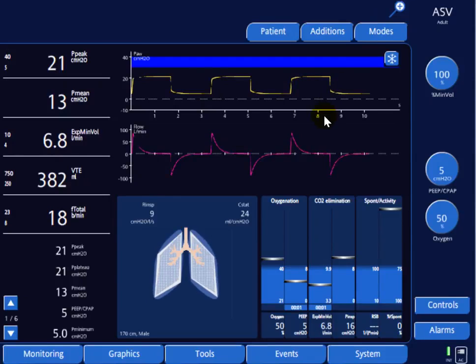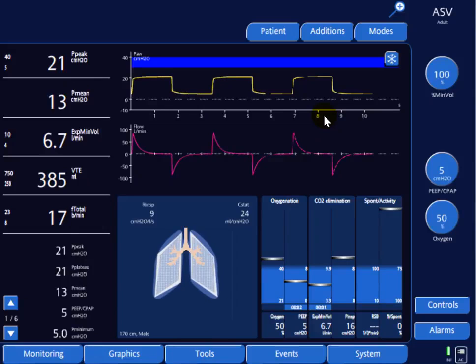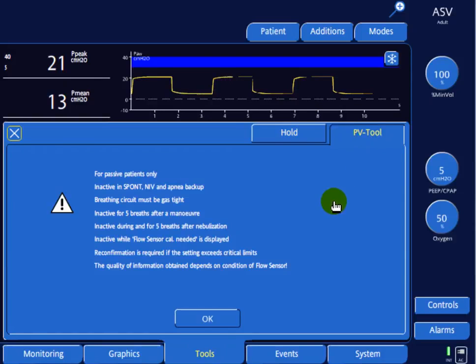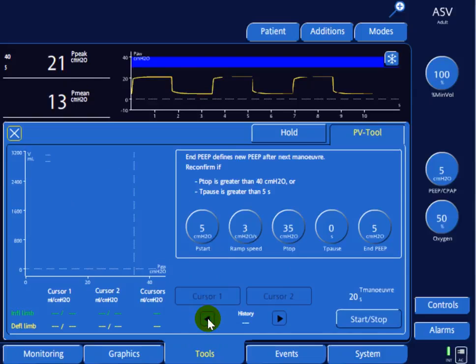The Protective Ventilation tool, or PV tool, is available on the Hamilton G5 and is used to determine the optimal PEEP for ARDS patients and determine the plateau pressure that should not be exceeded. To access it, click on Tools and then PV Tool. The patient should be apneic — well sedated and possibly paralyzed. The tool is not available in spontaneous modes such as pressure support ventilation or CPAP.